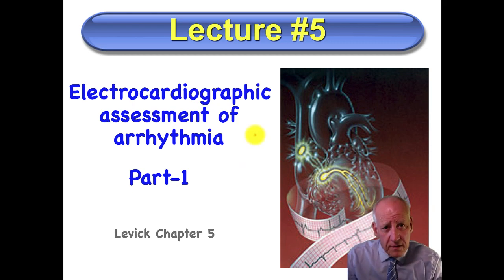Hello, this is part 1 of Lecture 5, Electrocardiographic Assessment of Arrhythmia. And our lesson today will be how to interpret an EKG in 4 easy steps.